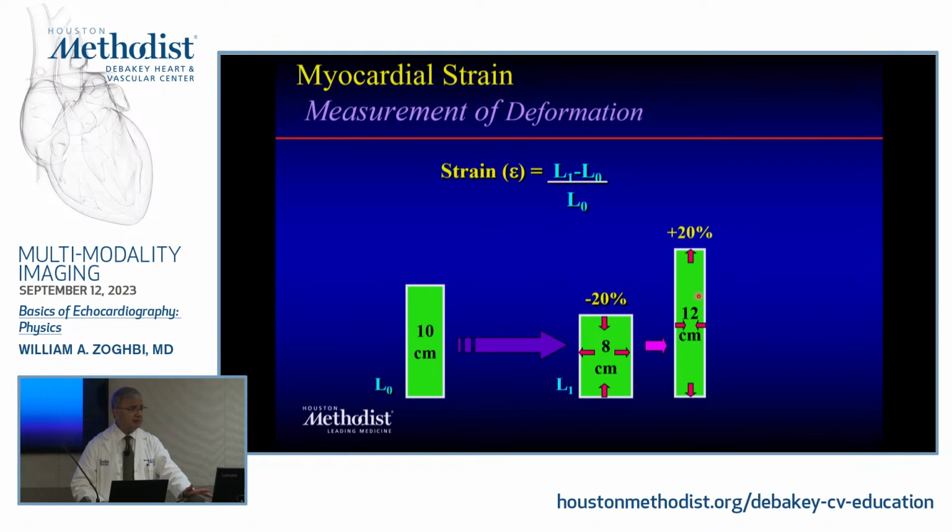And it's in percentage. And before strain, the only time you could look at percentage of thickening or something was by M-mode or 2D, where you have to measure it, but usually from the parasternal window. From the apical window, you can't measure anything really. But this is, I think, the major advantage of such.